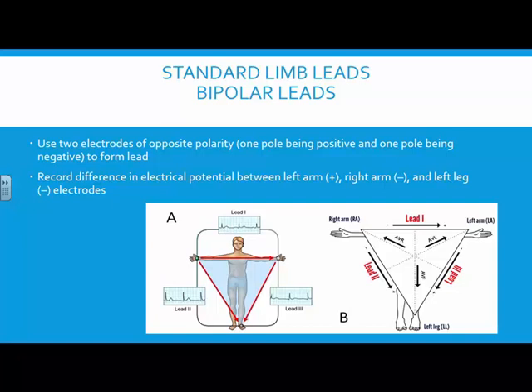But there's a couple of things that you need to understand about monitoring. You've got leads in a standard monitoring system. You've got 12 leads, hence the name 12 lead ECG. 6 of those lead views only require salt, pepper, and ketchup. That's going to be your standard limb leads and your augmented leads.